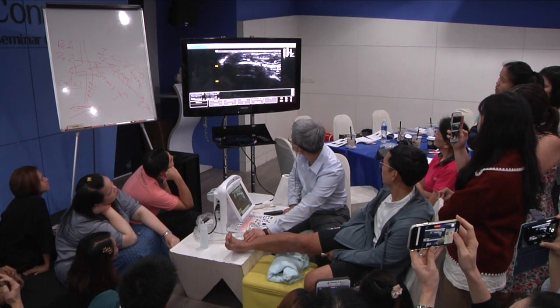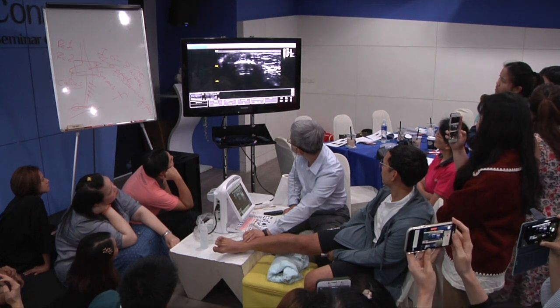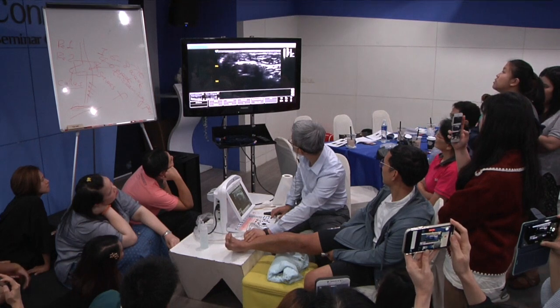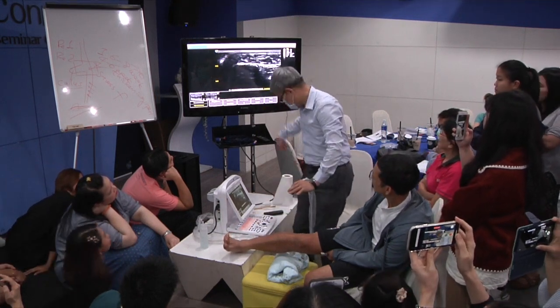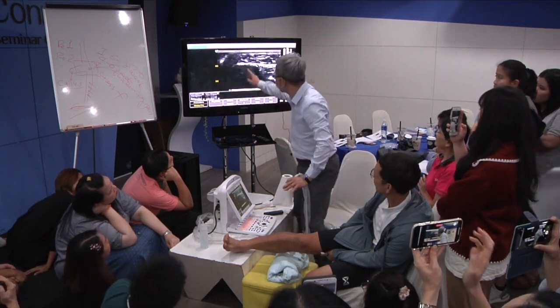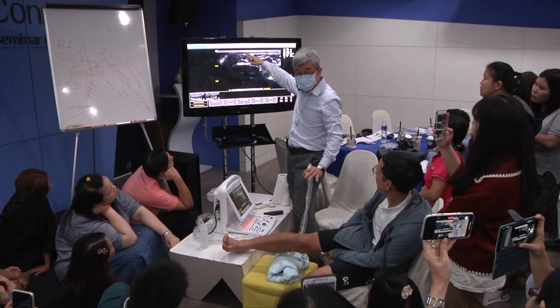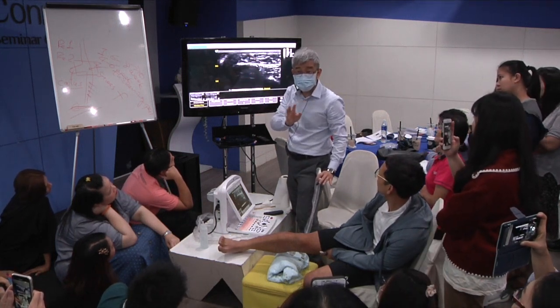Okay, stop. Then backwards. Do that again. More. Slightly. Good. Brevis, move this way. Longus, move this way. Okay? If you cannot do it, it's okay.